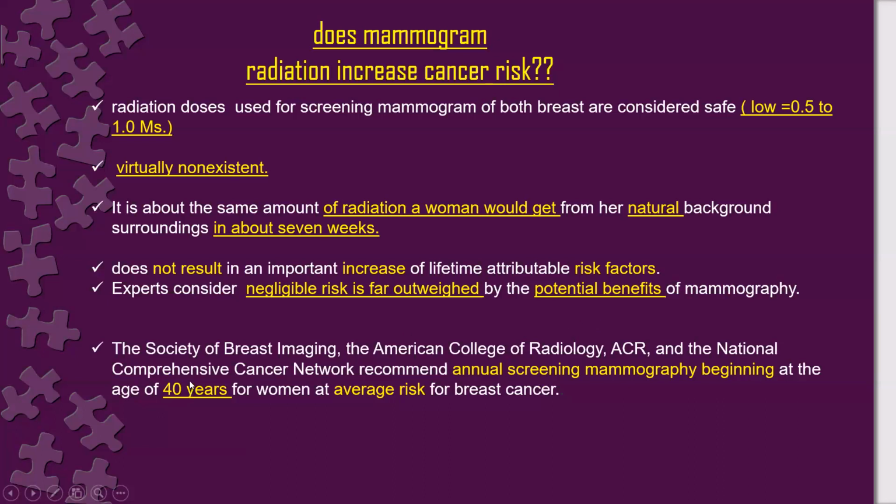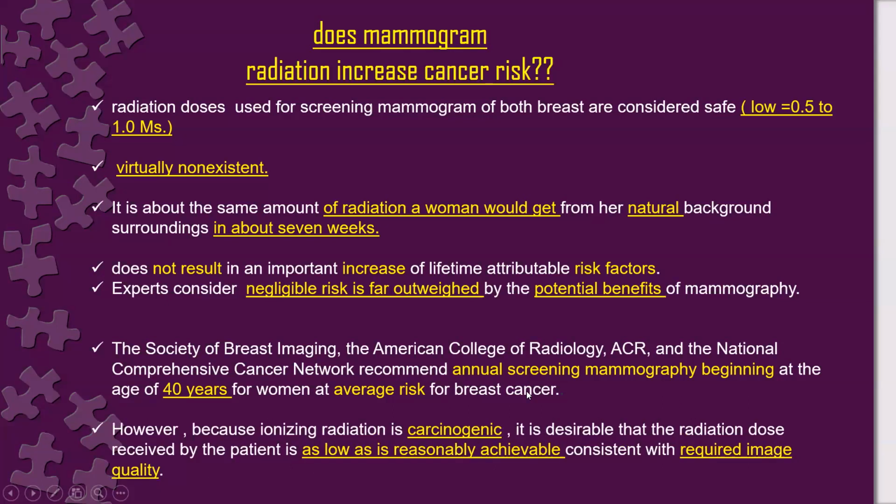Accordingly, the Society of Breast Imaging, the American College of Radiology and the National Comprehensive Cancer Network recommend annual screening mammography beginning at the age of 40 years for women at average risk for breast cancer.